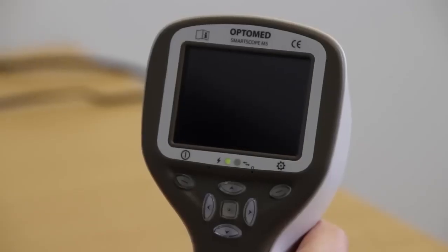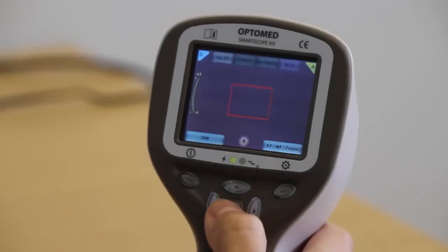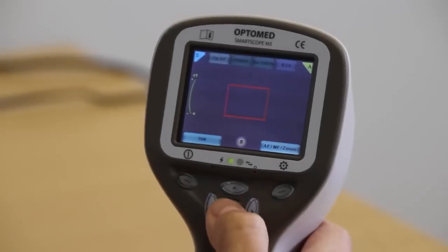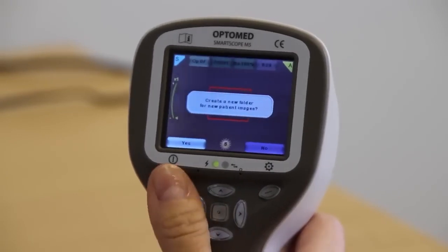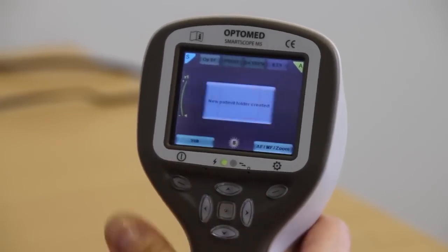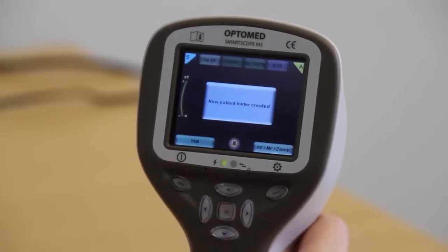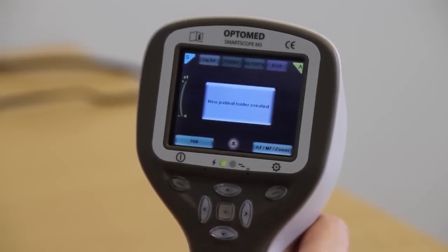If multiple patients are examined during one setting, create a new file folder for each patient by pressing and holding the middle key.